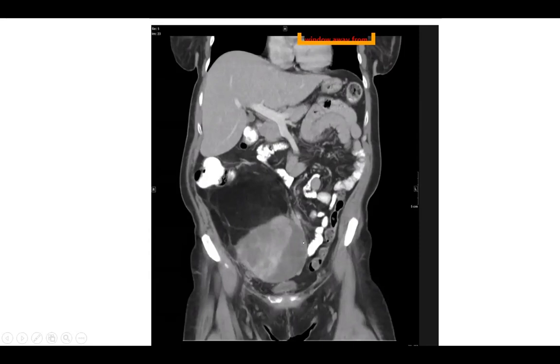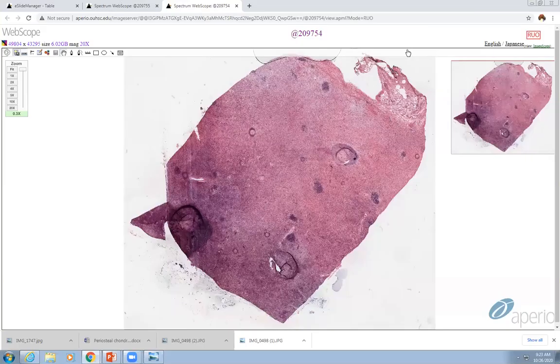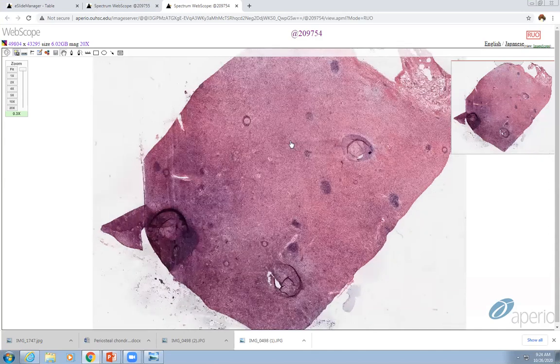She was referred to this hospital by an outside institution for definitive management. The patient was brought to surgery and a representative sample was submitted by the GYN oncologist prior to proceeding with more definitive evaluation. Here's the section submitted for frozen section. We have a little bit of frozen section artifact — some ice crystals — but at low magnification we can appreciate that this is not a usual epithelial tumor. It is a rather cellular tumor with clusters of blue nuclei and some peripheral tissue to the side.